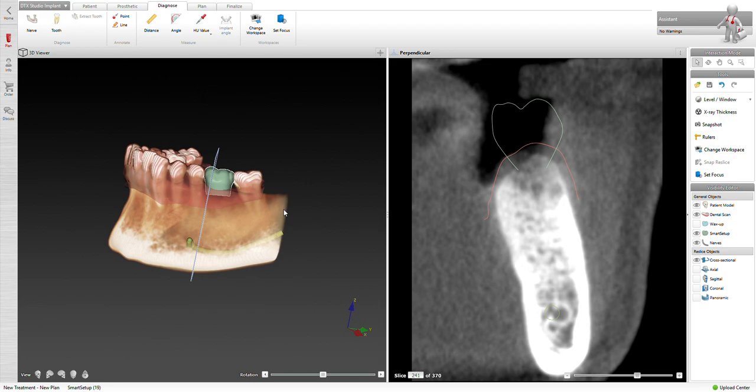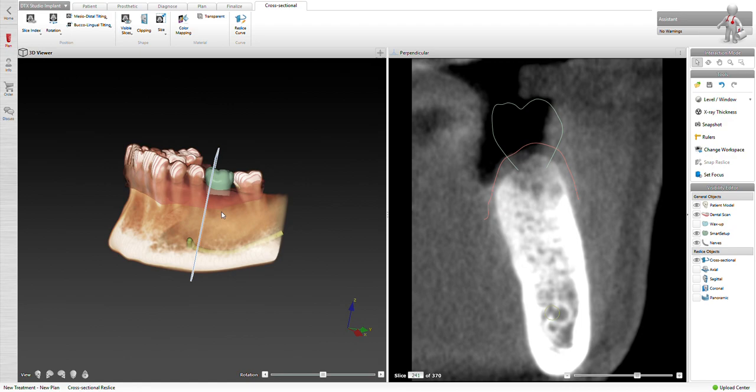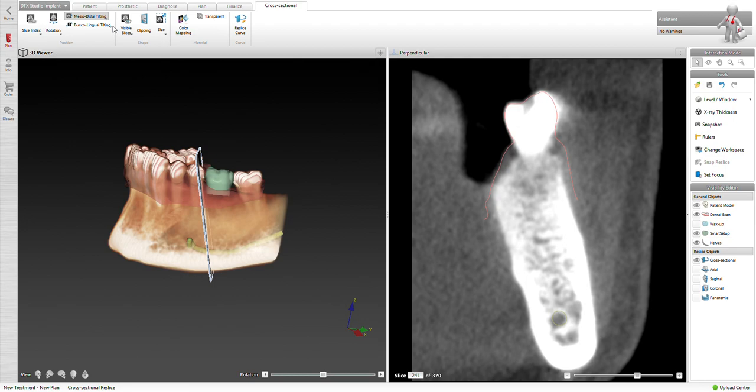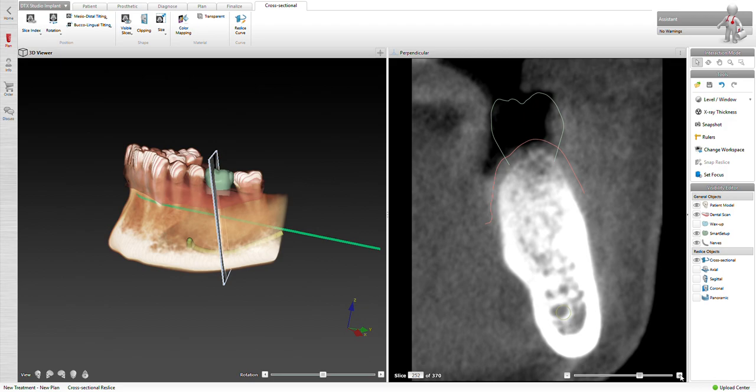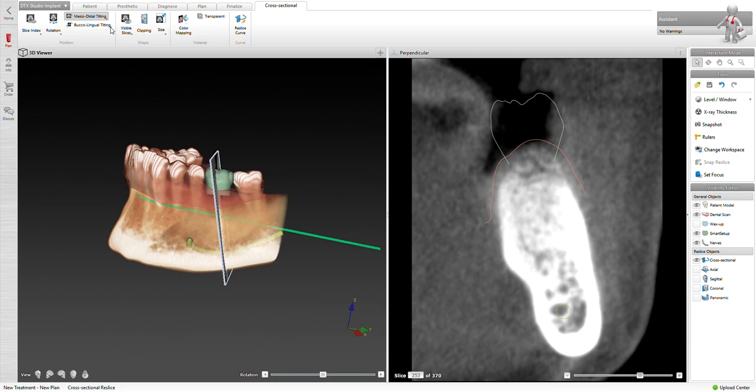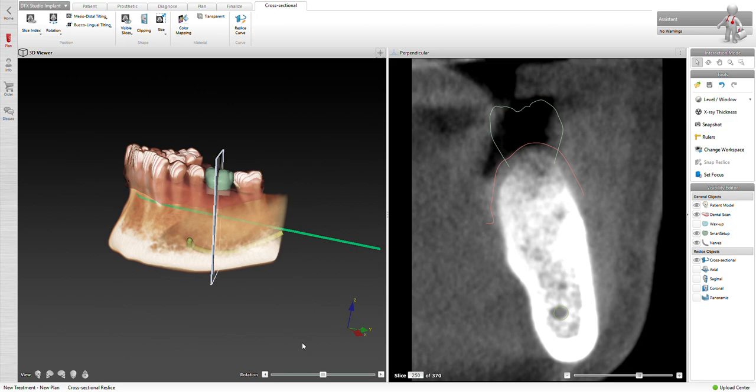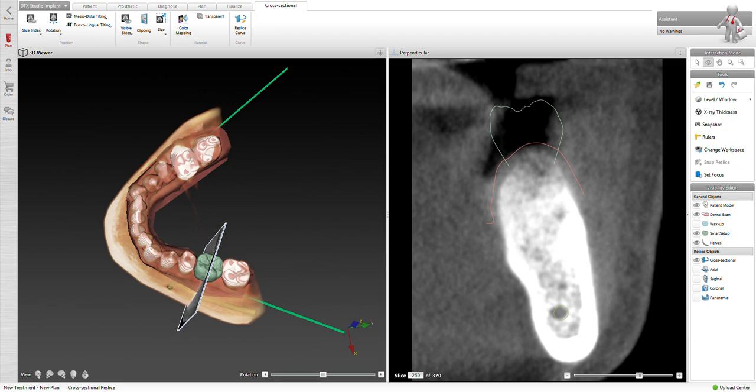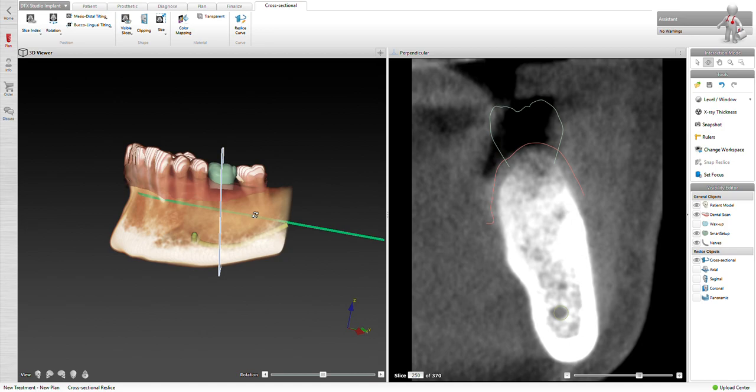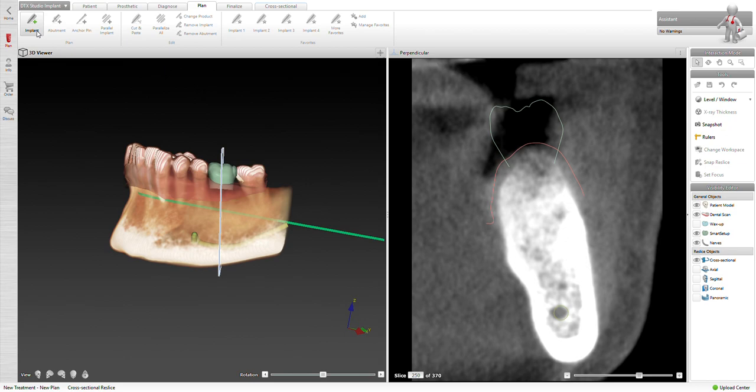Alright, we've done that. We hit finish and we have our nerve mapped out. Now before I plant an implant, I want to make sure that I have my axes correct. I want to rotate this, and I can click on the rectangle and that will give me commands, because this is not the optimal position. So I need to rotate it mesial and distal. That looks pretty good.